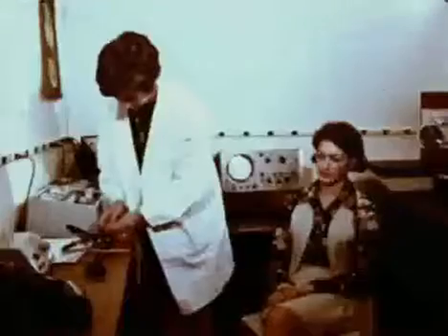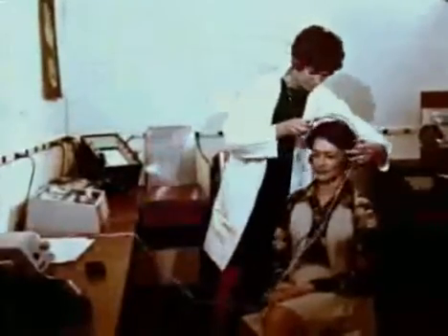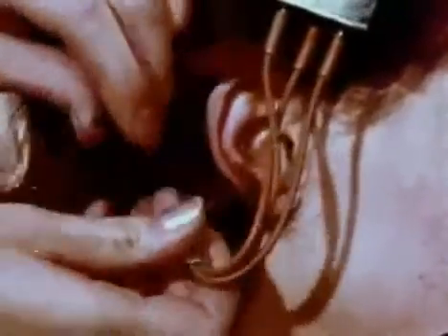After selecting a tip of appropriate size and ensuring that the ear canal is free of debris or wax, the pinna is pulled upwards and backwards and the probe gently fitted into the ear. It may be necessary to try an alternative size of rubber tip.